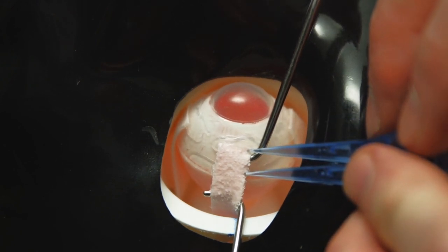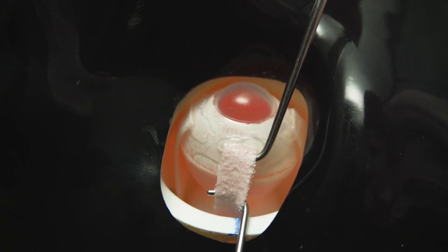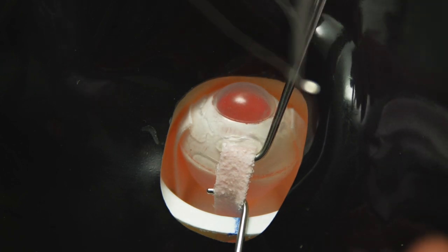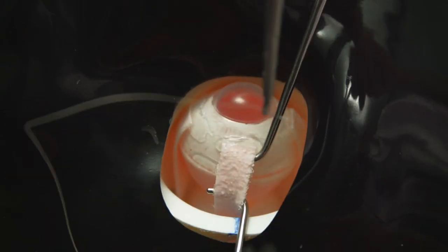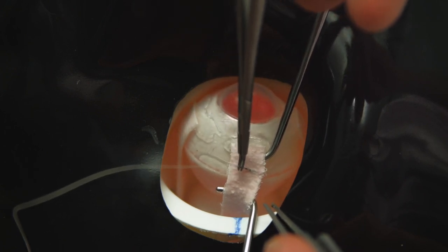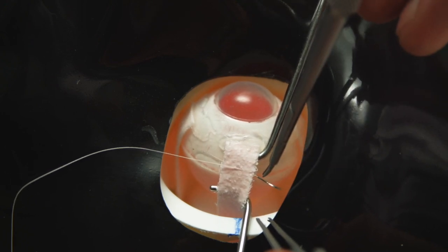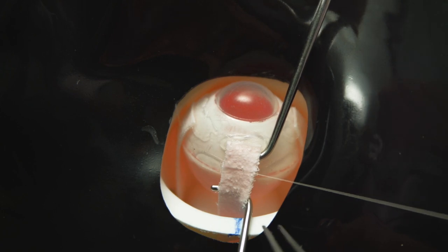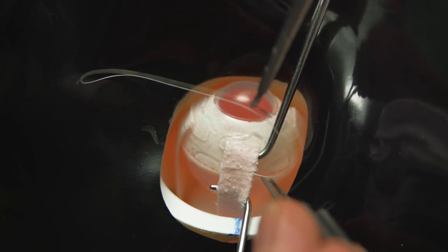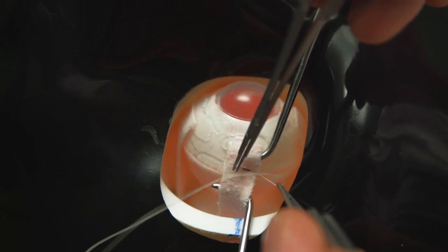Here we're showing a left lateral rectus resection — a 5mm resection, just being measured. There are of course many different ways of carrying out resection muscle suturing, and in this particular case we're illustrating an interrupted suture technique. Many surgeons prefer using a continuous suture technique, which can also be practiced using these eyes.